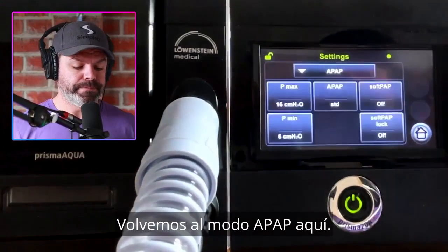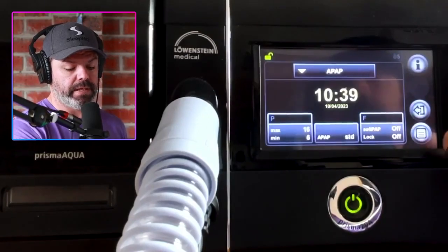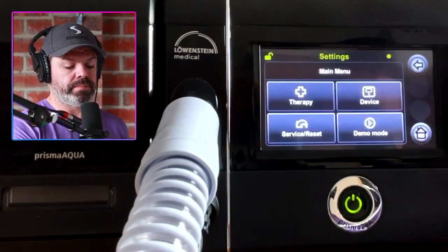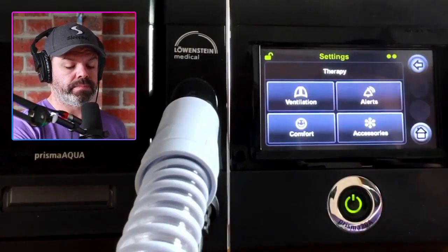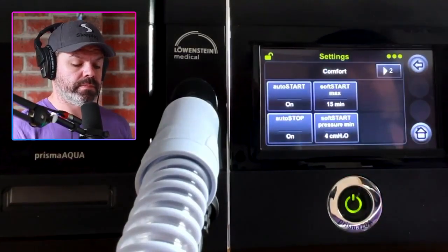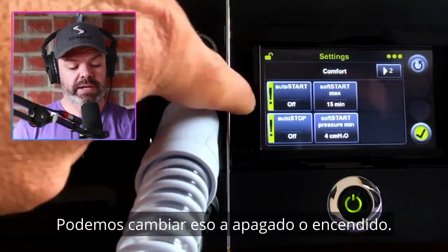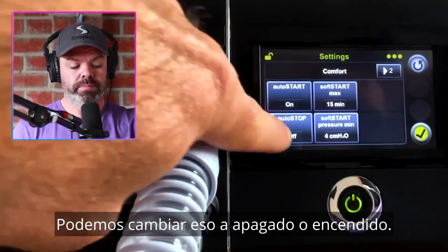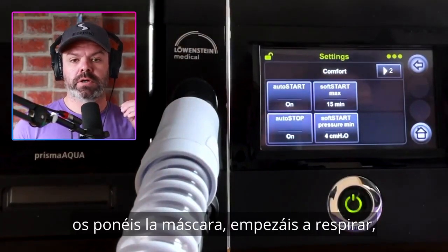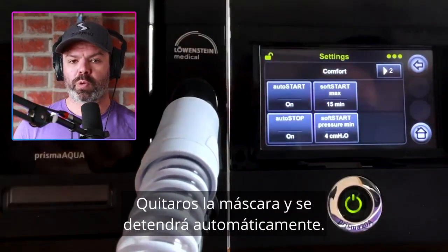Now we'll go to home, then click the icon down here, click therapy, and click comfort. On the left we have auto start on/off — we can change that. Auto start on means you put your mask on, start breathing, and the machine will start automatically. Conversely, take your mask off and it will automatically stop.